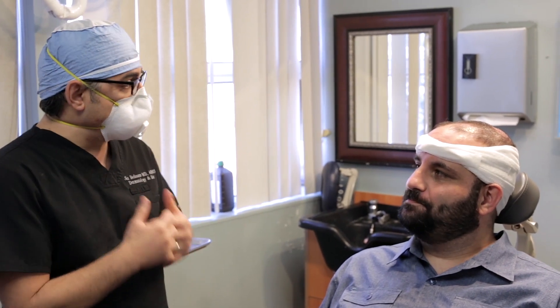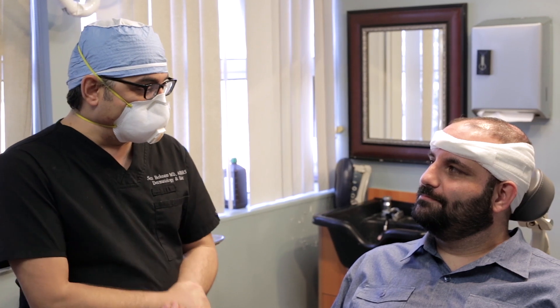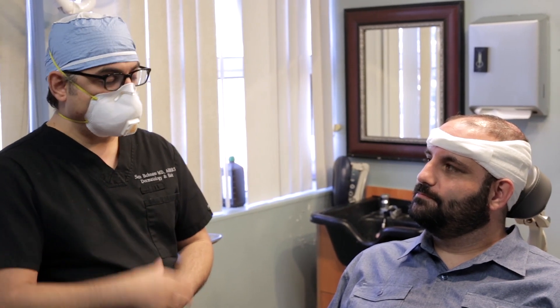I truly believe the results go hand in hand with experience. We're going to be following up over the next four to five months as the hair starts to grow out, and over the next year to see how the results grow and frame the face. Thanks so much for coming.